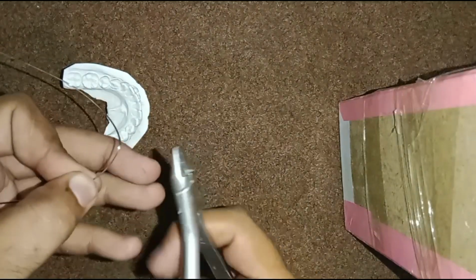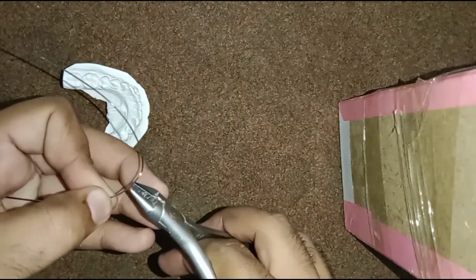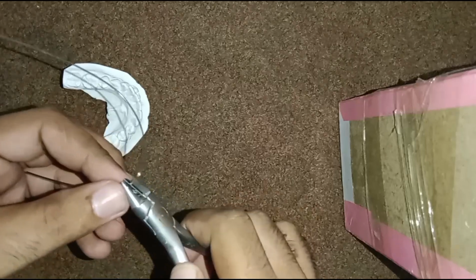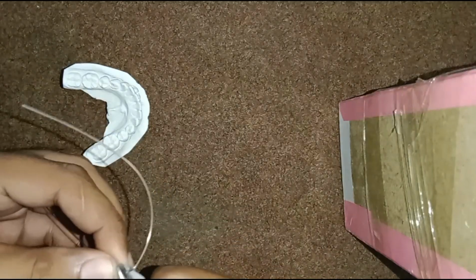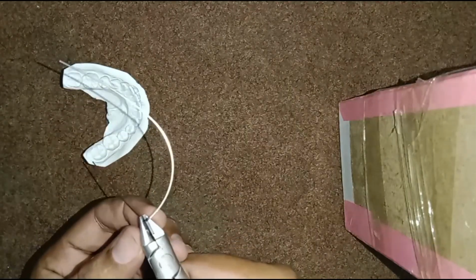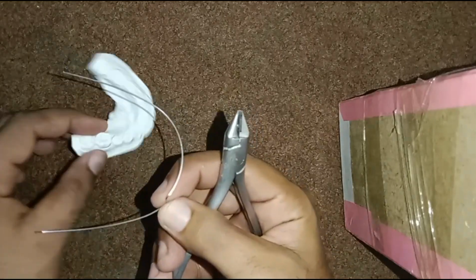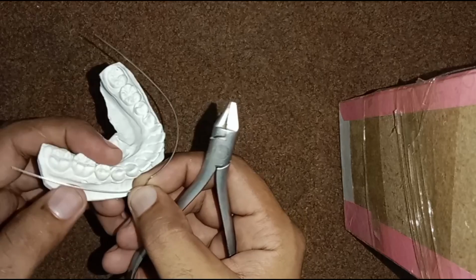Then we will hold the wire at 6 mm. We can place the mark at the 6 mm measurement. Then place a 90-degree bend again on the wire. Then place the wire on the model.